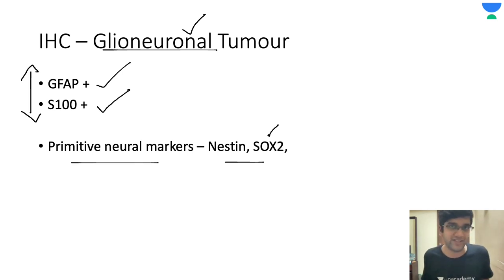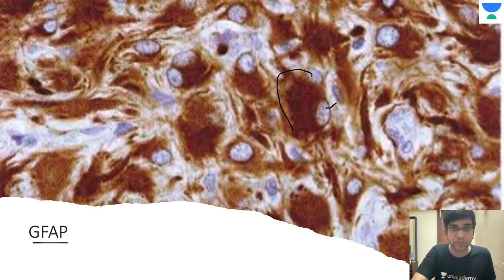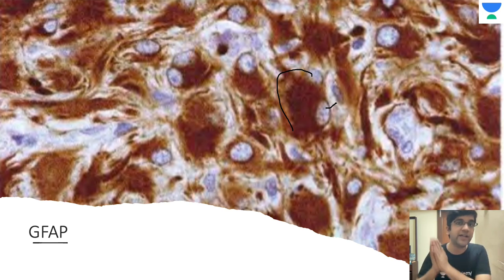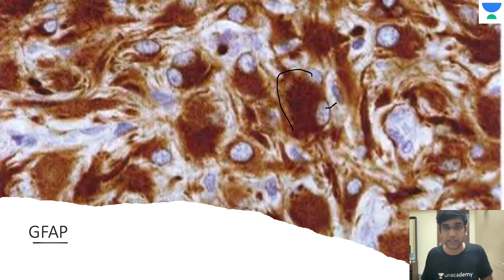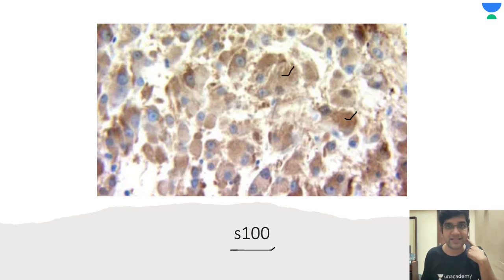My morphology plus GFAP and synaptophysin — definitely available in any Oncopath center — should be enough to call it subependymal giant cell astrocytoma. GFAP is a glial fibrillary acid protein and is a cytoplasmic marker. Whenever you are interpreting IHC, two golden rules: always have a control, and make sure if GFAP is a cytoplasmic marker, it should be positive only in the cytoplasm — if it's positive in the nucleus as well, be hesitant to call it GFAP positivity. S100 is also positive — even if it's a weak positivity, it's still cytoplasmic positivity. It's a stain positive in both neuronal and glial tumors, which proves the glioneuronal origin of SEGA.